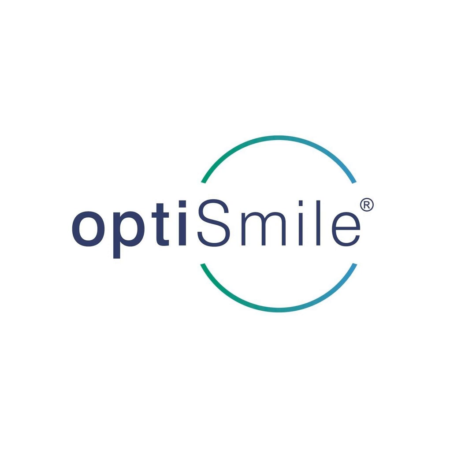So at OPTISMILE, if you've come to see us and we've taken a 2D X-ray and a 3D X-ray, we generally won't take another X-ray for another 3 years. While there are dentists that believe in taking X-rays every year or every 2 years, it is often customized depending on what you see. If you get an X-ray today and there's nothing there, you don't need an X-ray for another 3 years. If we take bite wing X-rays and you need 3 fillings and there's 2 or 3 other areas where cavities are starting, we may recommend that you have another X-ray. At OPTISMILE, we would take another X-ray like that in about 18 months. We wouldn't X-ray the same tooth every 6 months, but it's generally customized to the patient's mouth and to what's going on.